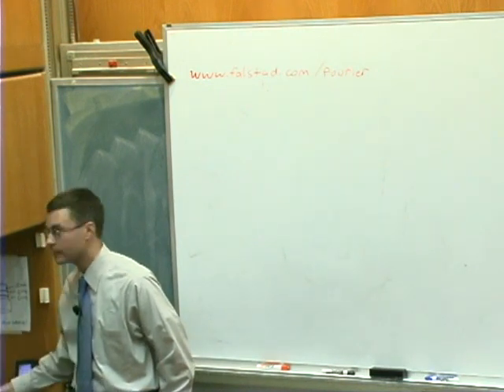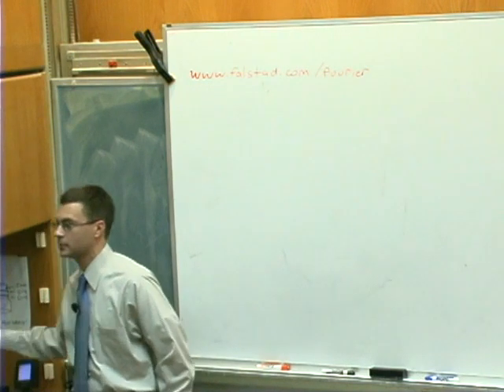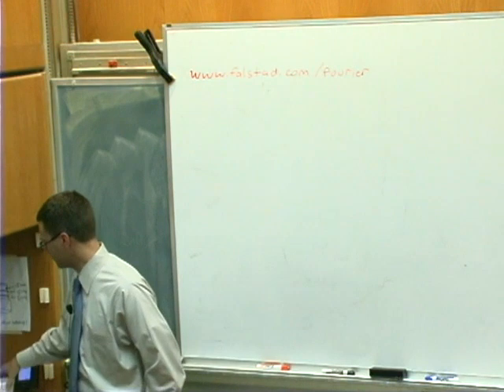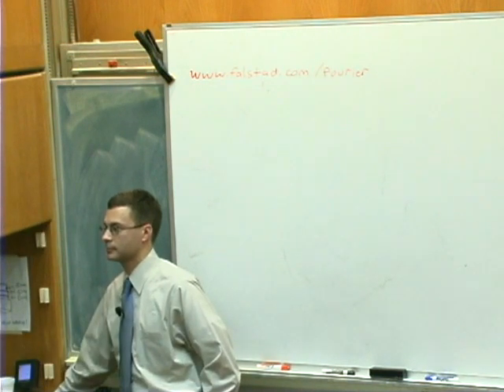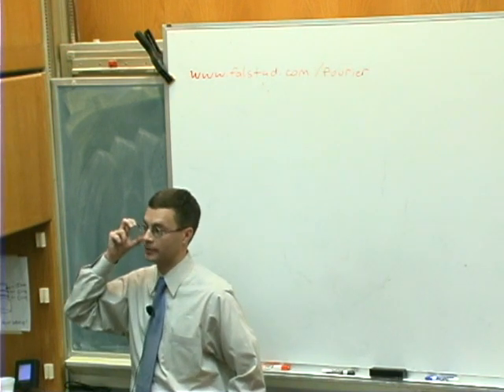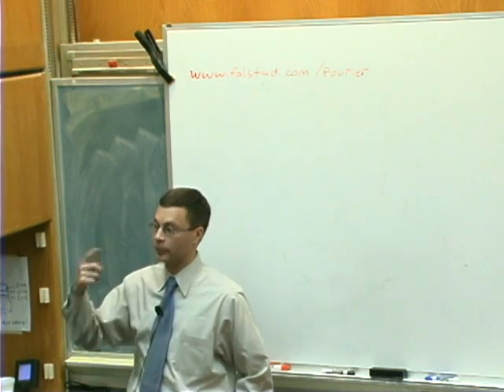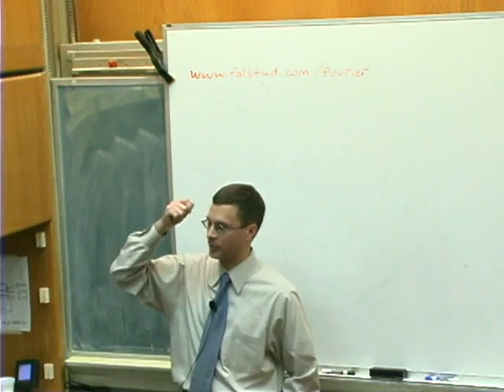So Jeff, you may have answered this, or somebody else may have asked: is the 1 over f spectrum reflected outside the sample indicative of 1 over f noise in the sample? For example, if you put a subject in the scanner and put a water tube phantom next to their head, could you measure 1 over f noise from the phantom? Right, this has been done. Dan Kimberg and I did experiments like this some years ago where we taped big jugs of water to people's heads and put them in the scanner.